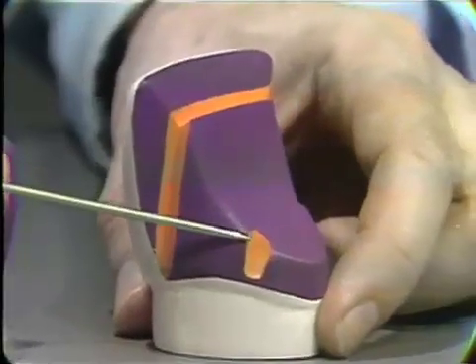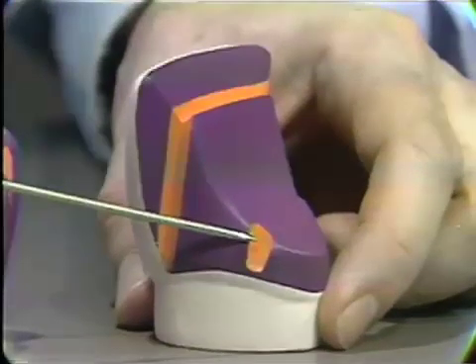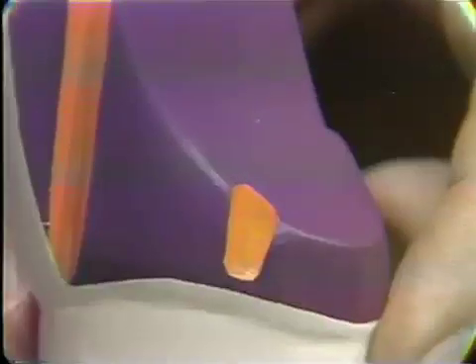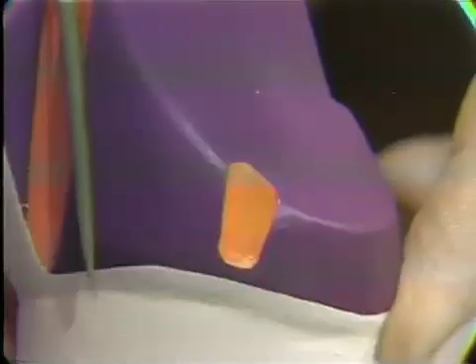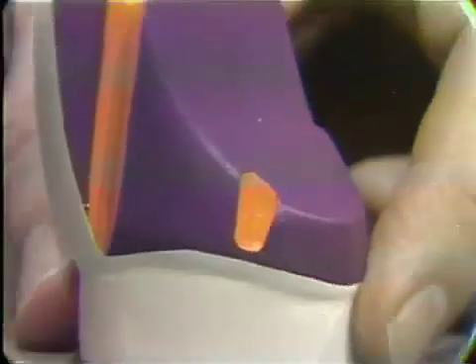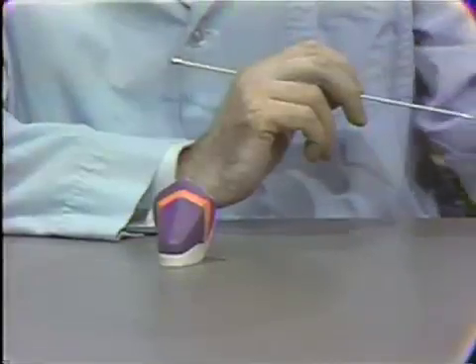Other additional retention that can be placed in three-quarter crowns are these little grooves placed almost anywhere around this lingual surface, wherever they may be. If you're short of retention, if these grooves are not as long as you'd like, you can get additional retention from cutting little lugs or grooves into the surface, as you see in that particular one.